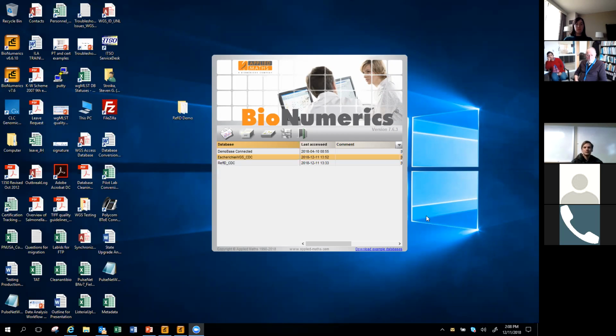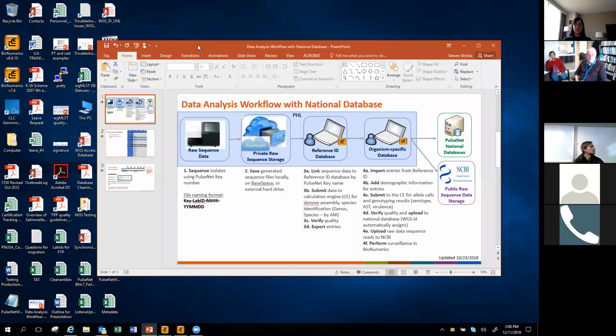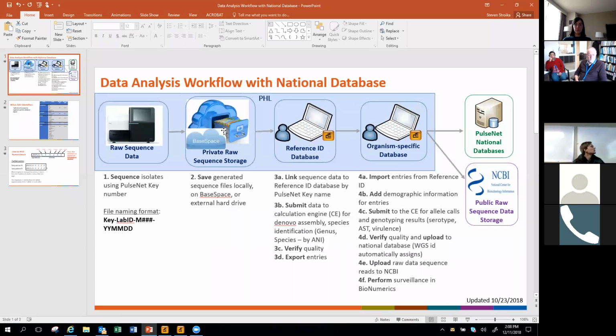So instead of going through a PowerPoint showcasing all these things in a flat format, I thought it might be more beneficial for you to actually see it in action. So hopefully this BioNumerics demonstration will go off without any technical hitches, but that's always a threat when you're doing something live. To start off, I do have a couple PowerPoint slides just to orient you on what we're going to be talking about.